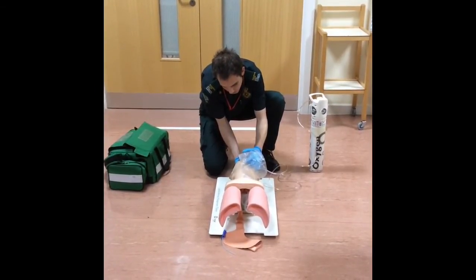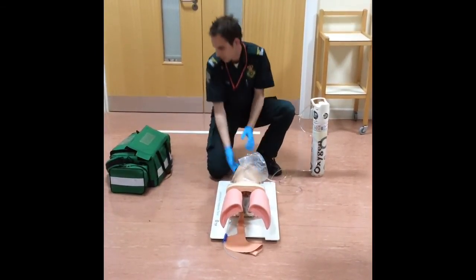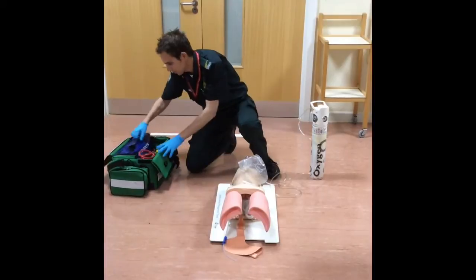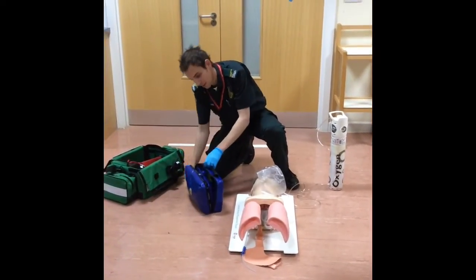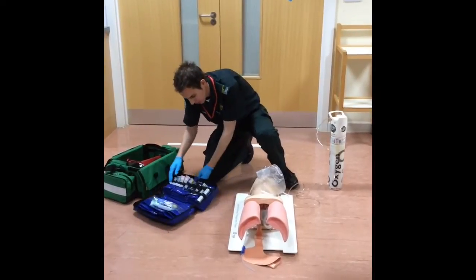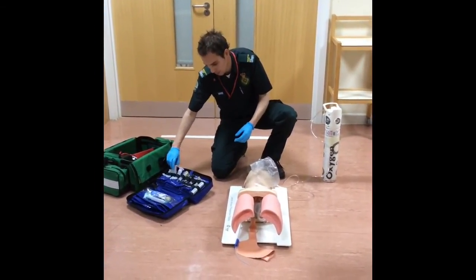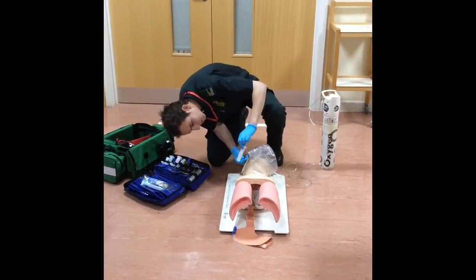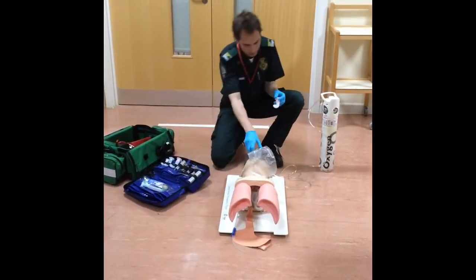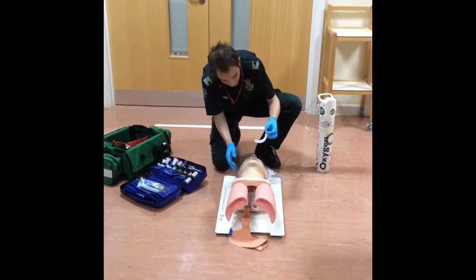I can still hear the snoring noise, so I'm still concerned that there is an issue with the airway. So at this point I'm going to progress that to a basic airway adjunct, also considering ventilating the patient rather than just putting in the adjunct. But at the moment I know that they're making respiratory effort, so I'm going to leave that. I'm going to size the airway adjunct from the incisors to the angle of the jaw. Remove the mask, have another look in the mouth, consider suction.